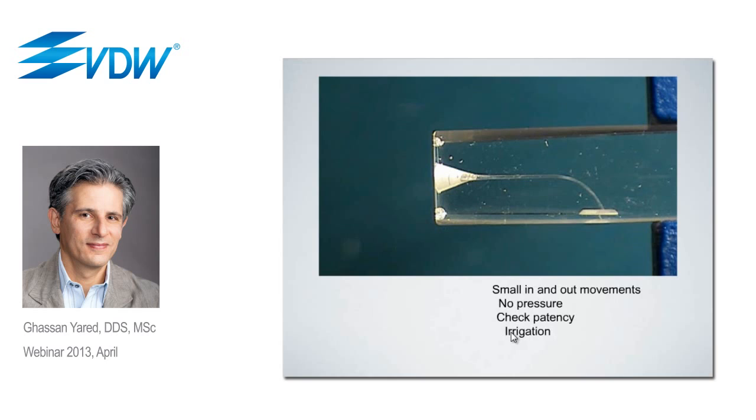Now I want to show you a video that demonstrates the technique of single file reciprocation with the R25 or the other Reciproc instruments.